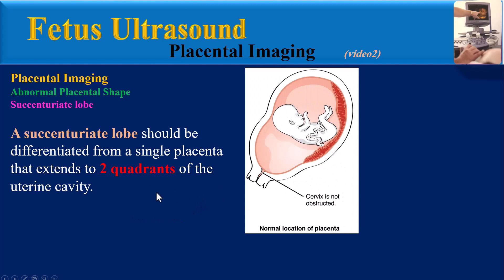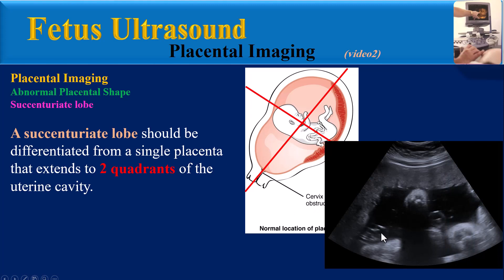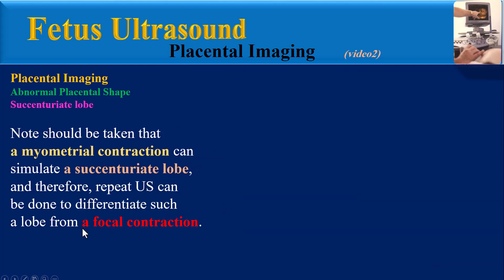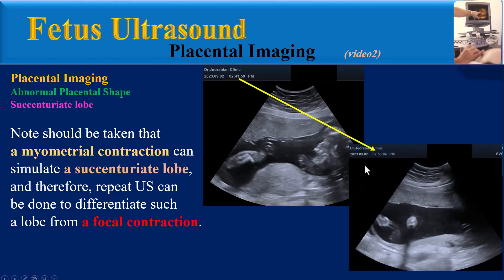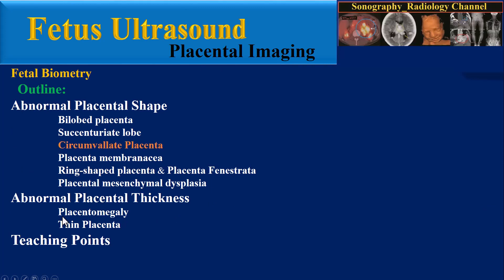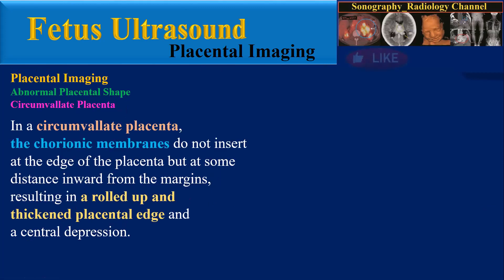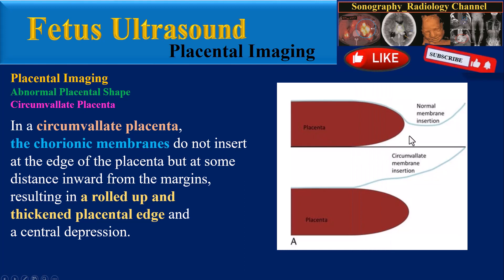A succenturiate lobe should be differentiated from a single placenta that extends to two quadrants of the uterine cavity. Note should be taken that a myometrial contraction can simulate a succenturiate lobe, and therefore repeat ultrasound can be done to differentiate such a lobe from a focal contraction. In this ultrasound image the main placenta can be seen anteriorly and a structure similar to placenta can also be seen, but after about 15 minutes that structure disappears, confirming it was a focal contraction.